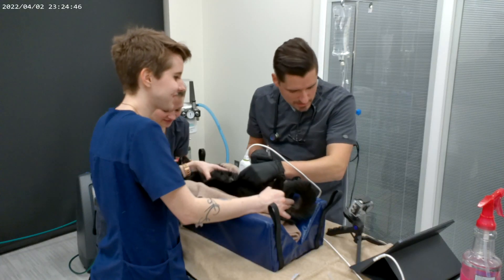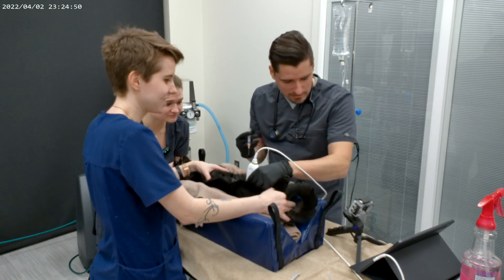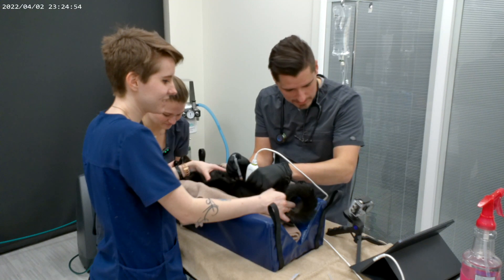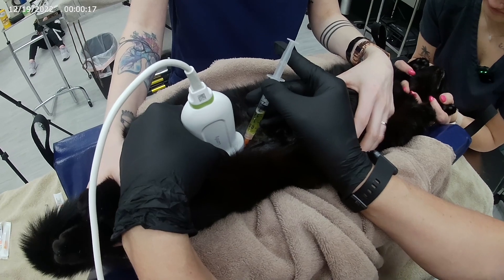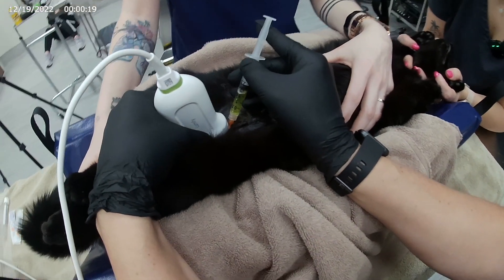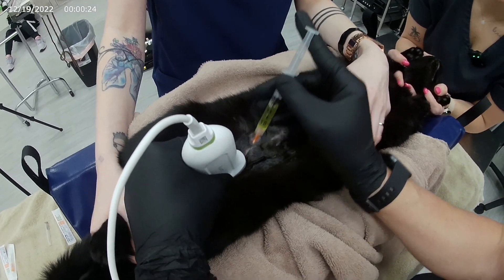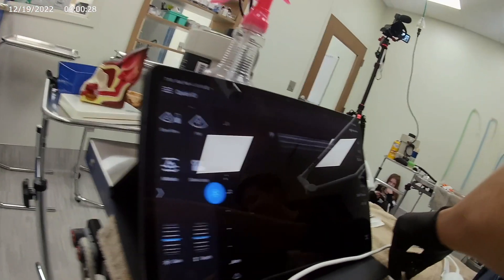The ultrasound probe is gonna go on his belly and we're gonna visualize the urinary bladder. The urinary bladder is going to appear as a big circle with urine in it, which is gonna look a little bit black or dark. Then we're gonna take our needle, place it next to the ultrasound probe, advance it into the abdomen, watch the little needle appear on the ultrasound image, and pull back on the syringe so it fills with urine.